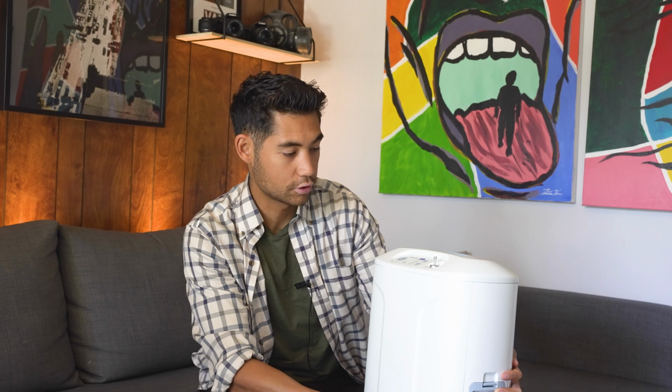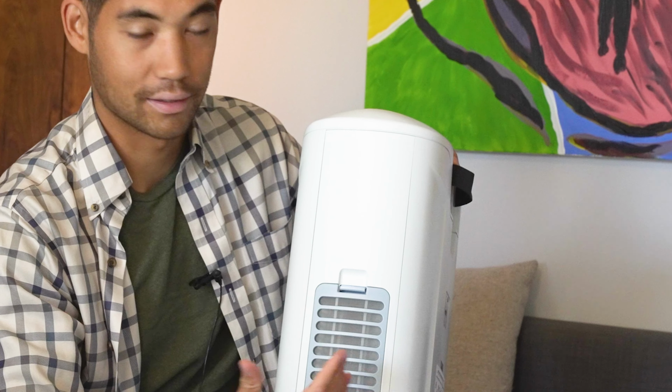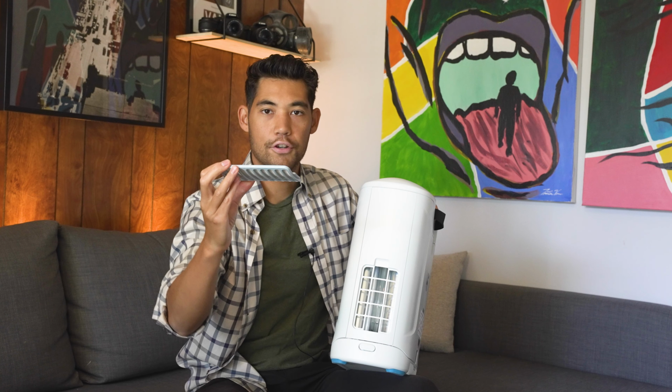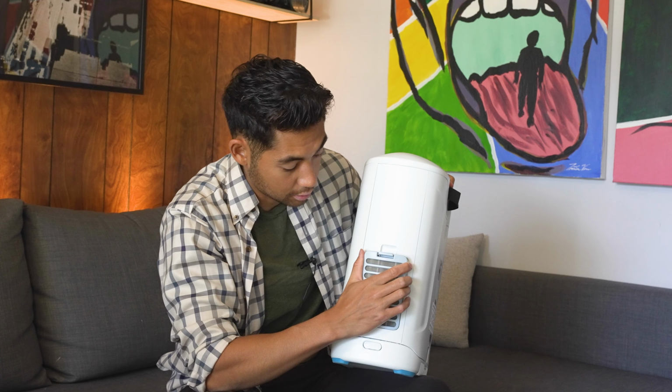Now, I mentioned a couple filters, so I'm going to go through them one by one. So when you have the air intake into the machine, it's first going to go through this intake here. That's your particle filter. This particle filter you can take out and you should be washing at least once a week. So you just push it down and pull it out like that. And you're just going to use a little bit of mild detergent like Dawn or some little dish soap, not too much, and just put it on, rinse it off, and make sure it's nice and clean. And once it's dry, completely dry, then you put it back on your concentrator like so. Always put the particle filter before you turn it on. Okay, so that's the first filter.